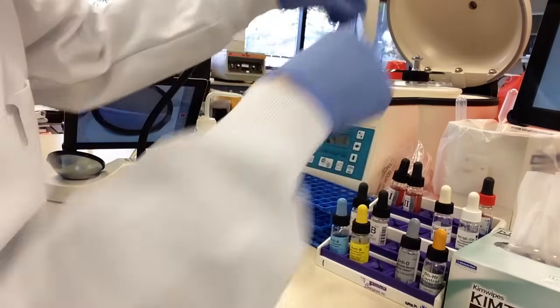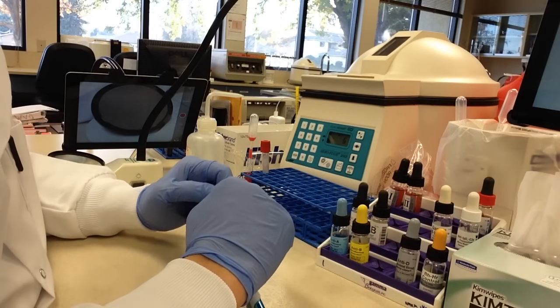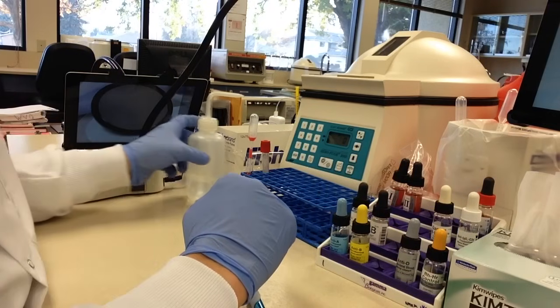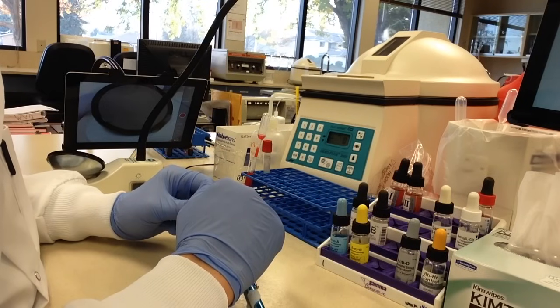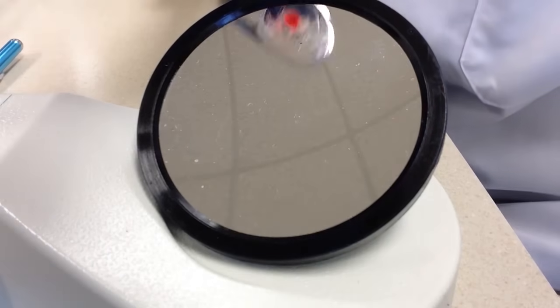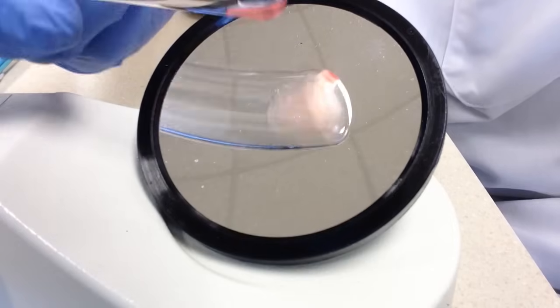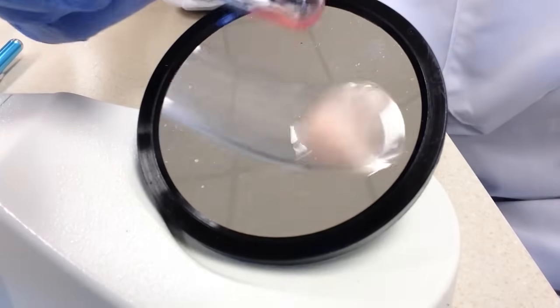Mix slightly and spin. We are at the AHG phase. Let's go ahead and read this tube. That button is off and that is smooth, so we are going to call that negative.